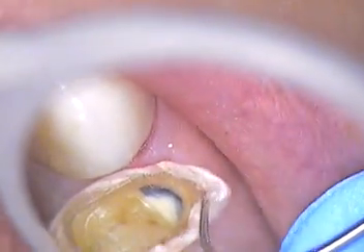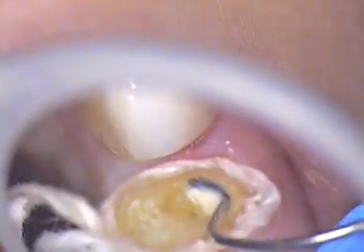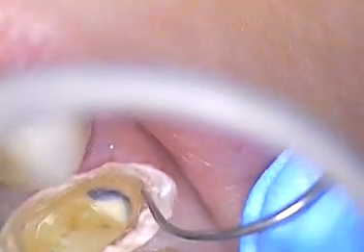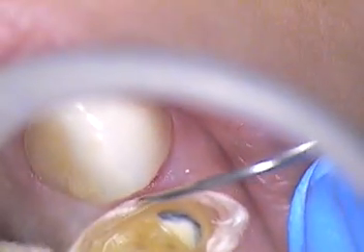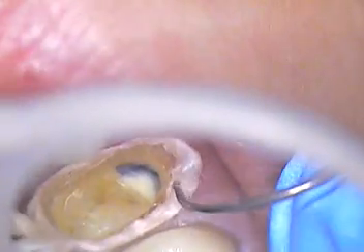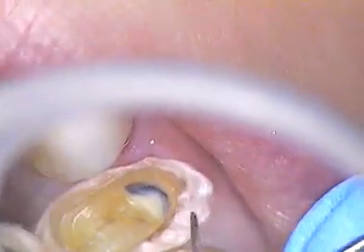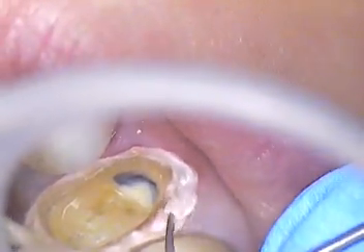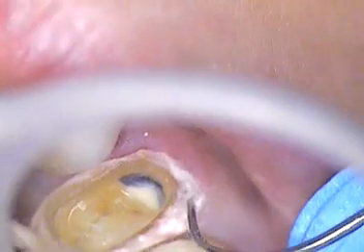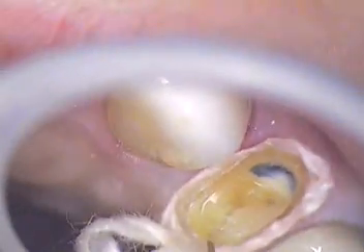You've witnessed our technique — feel free to comment. I know most of you are wondering what's going to happen with that dark area. I believe our lab can definitely mask it out with their layered porcelain and do quite well. We can take the extra precaution of using a lighter cement as well, so we'll see how it goes. I just don't want to be cutting into a tooth if I don't have to. If it were near the gum line I'd probably add some composite, but I think we should be okay.